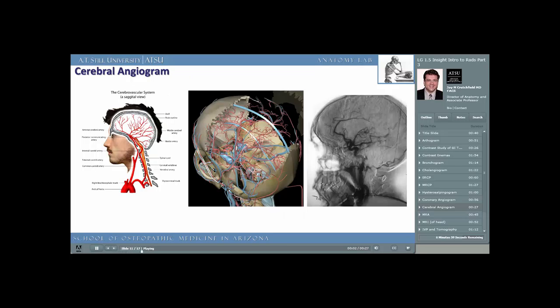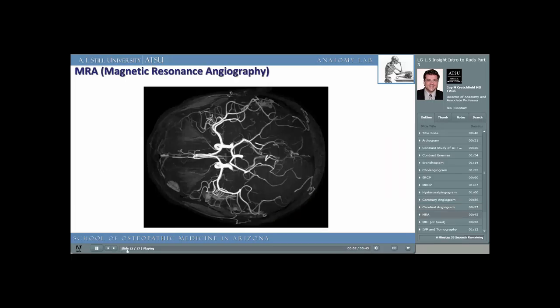Just like coronary angiograms, we can also obtain an image under fluoroscopy of the vasculature of the brain — this is called a cerebral angiogram. Review the anatomy of the image on the left and see if you can locate those vessels in the radiograph on the right. The middle image is taken from Cyber Anatomy, a program you'll have access to via the Learning Resources Center through AT Still Memorial Library. Just like classical angiography, we can use an MR scanner to obtain images of the blood vessels, much like the MR scanner was used to give us an image of the bile ducts in the MRCP.